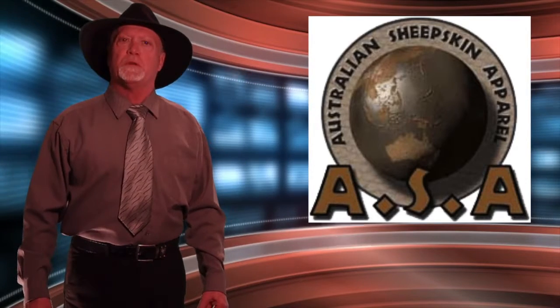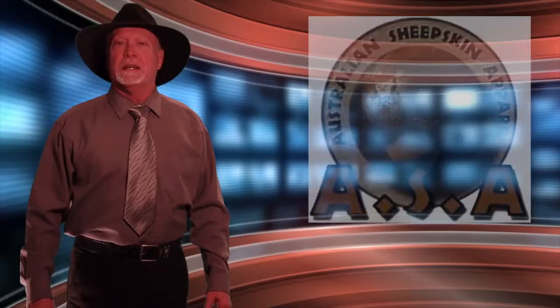In this session we're going to be talking about laundering or washing Australian medical sheepskin with Skin Sand detergent. Skin Sand detergent is the only detergent allowed to be used for laundering Australian medical sheepskin, as it has within it the chemicals that keep the sheepskin working and keep it effective for use. If the Australian medical sheepskin is laundered in anything other than Skin Sand detergent, the product loses warranty.